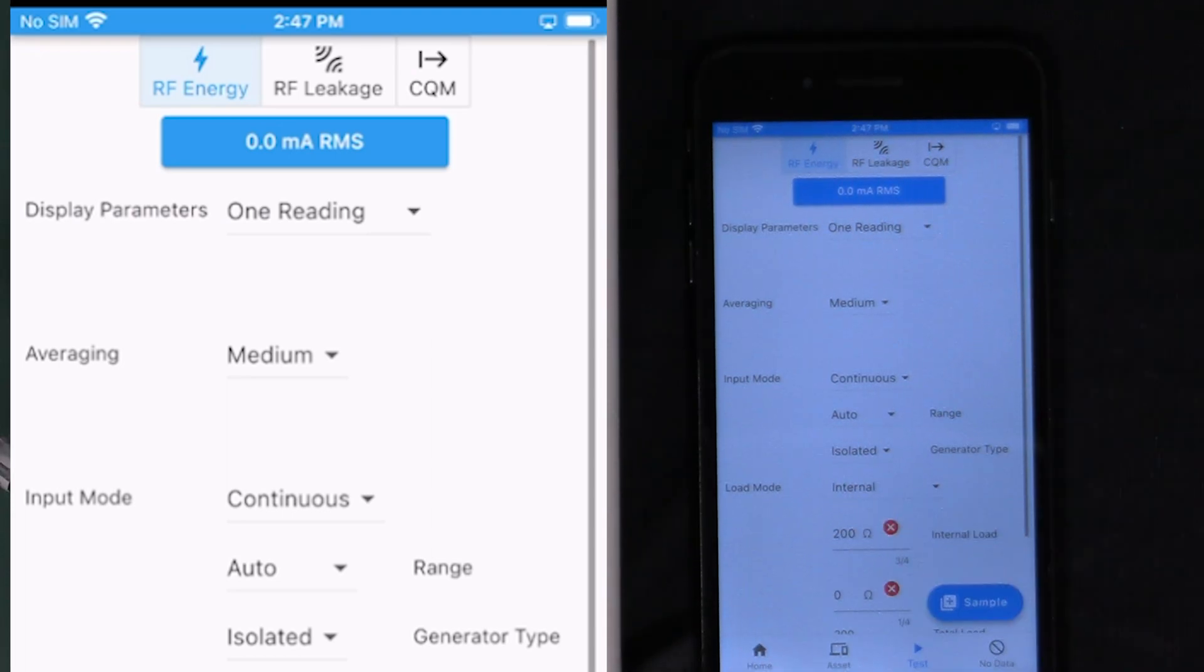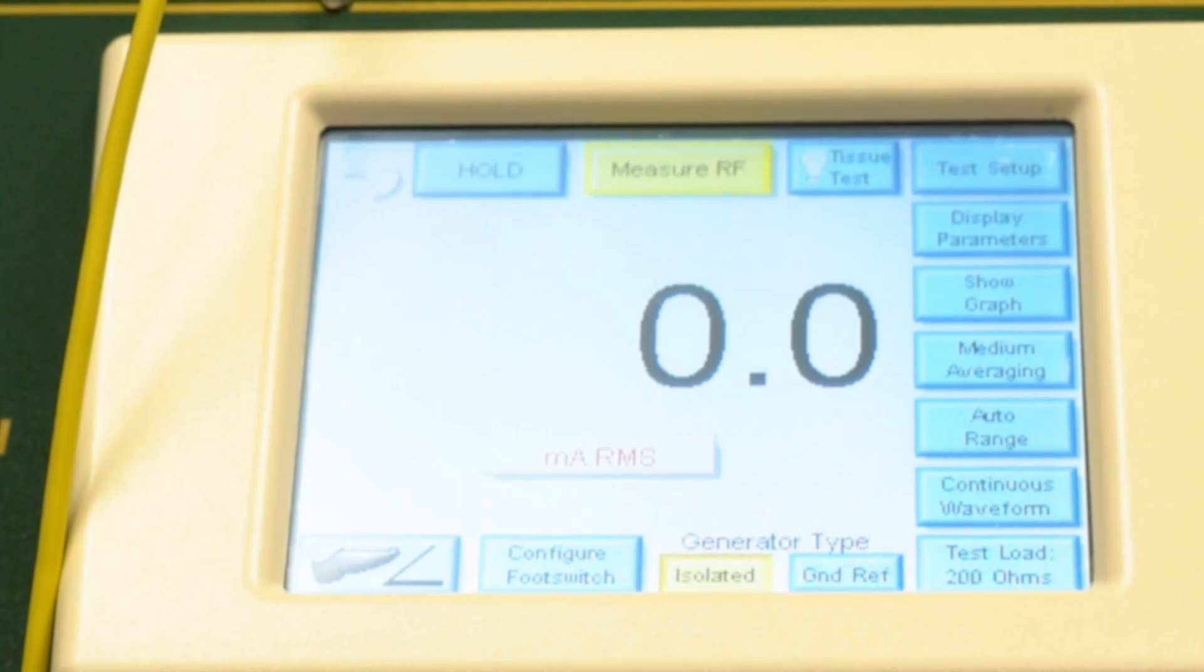At the top of the screen we can see RF energy, RF leakage and CQM. These are the three main test modes that we can test using the 2400. We'll start with RF energy.